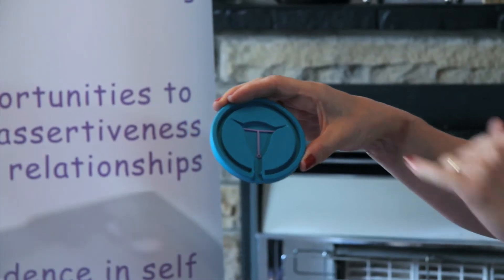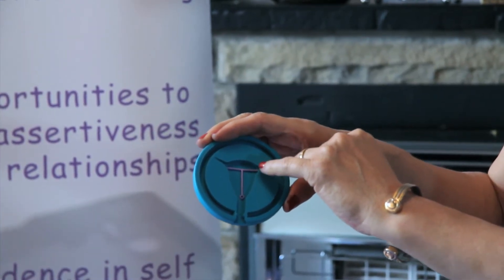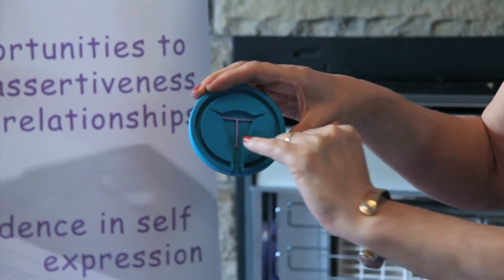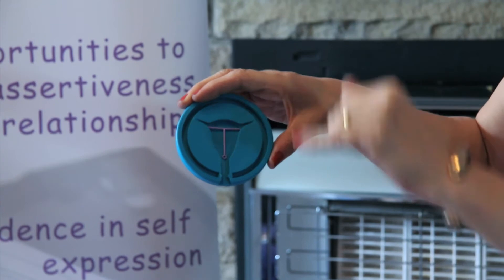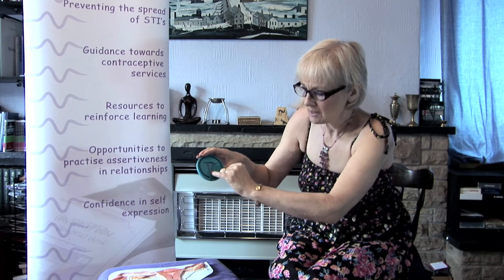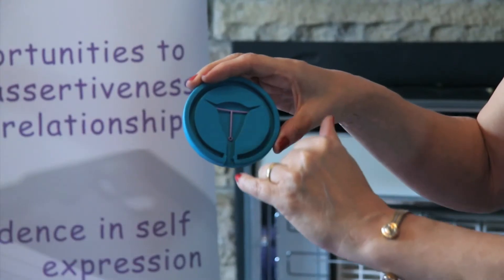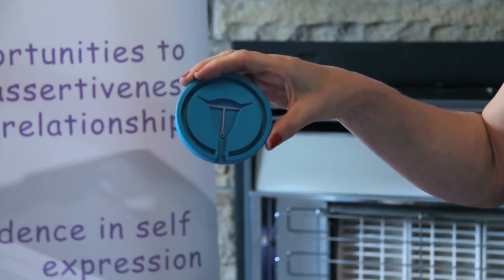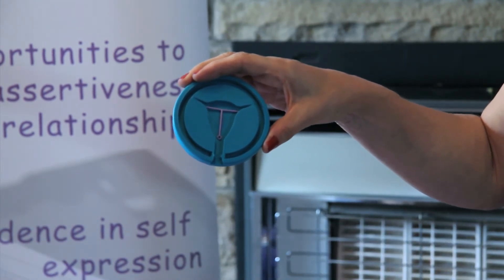They're generally T-shaped. This is a model IUD because the real IUD has some copper on the arms and copper on the down bit of the T as well. A real IUD has a string coming out of this ring so that it sits just outside of the uterus and the woman can feel it in her vagina.